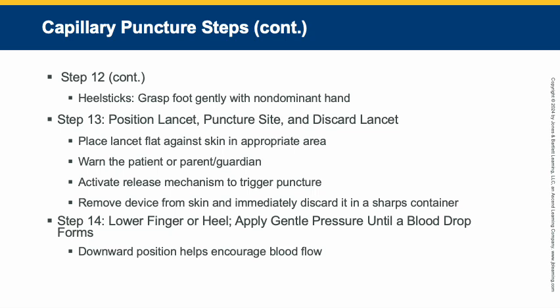Double sticking is never acceptable. If blood does not flow or stops flowing at any time and cannot be restarted, a new puncture at a different site must be performed.